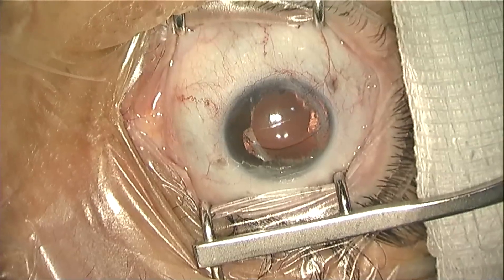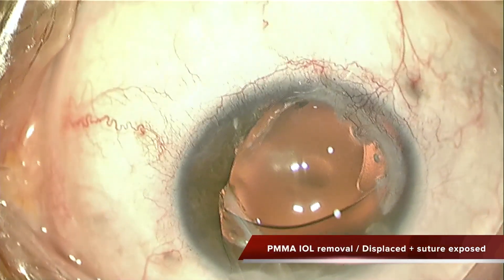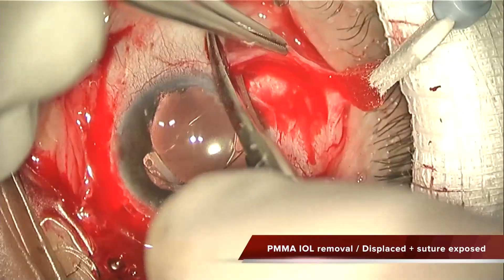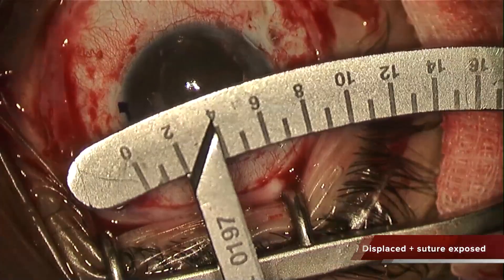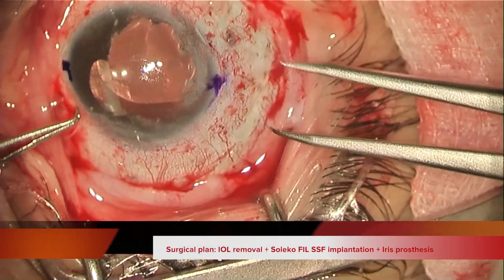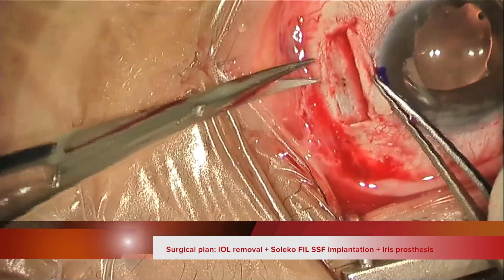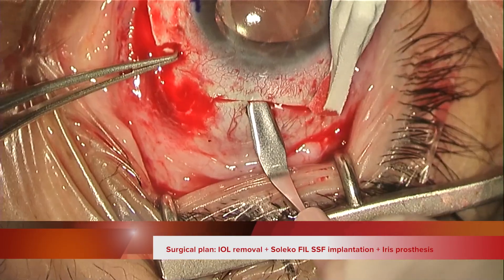This was a case of a patient who had an ocular trauma and was treated with a PMMA intraocular lens. Unfortunately, despite being well with a quite nice visual acuity, he was complaining a lot about glare.